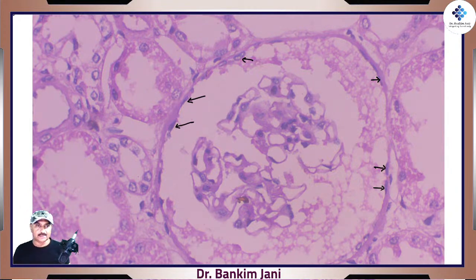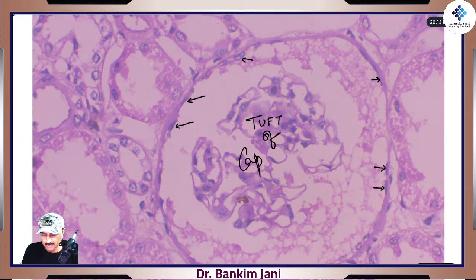Inside the capsule, these are the capillaries. This is called the tuft of capillaries. Only when you see it in 3D will you appreciate that there is one small capillary going in and one coming out, so afferent and efferent. Because they then divide into several capillaries, the pressure increases, and that's where the fluid and electrolytes ooze out, and then they all move further.